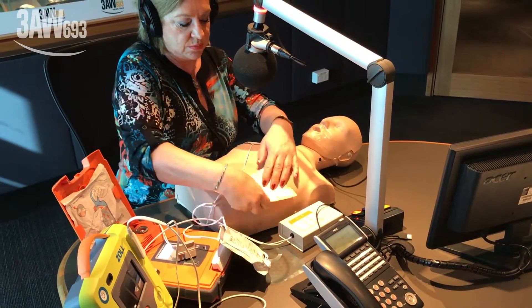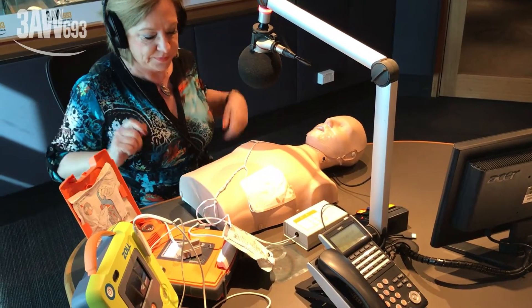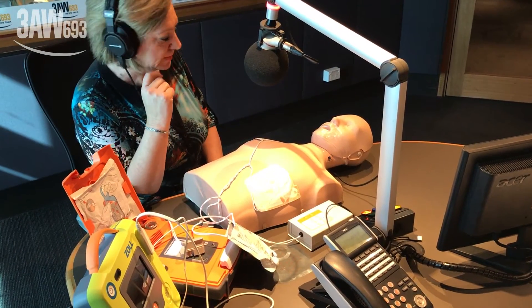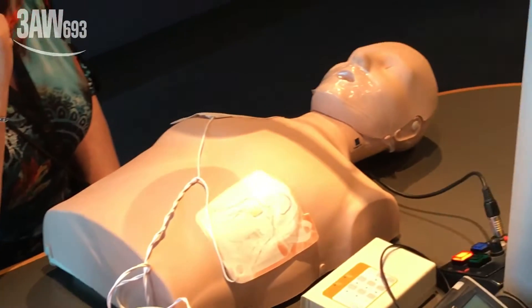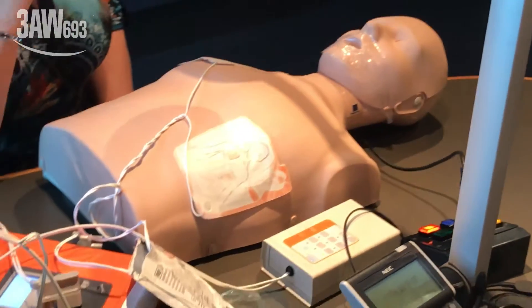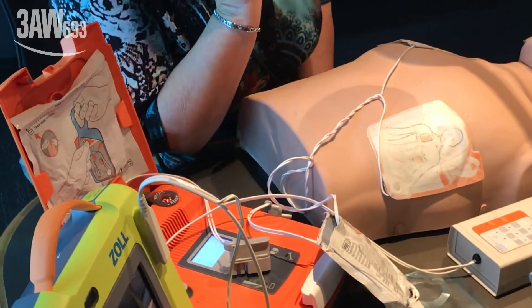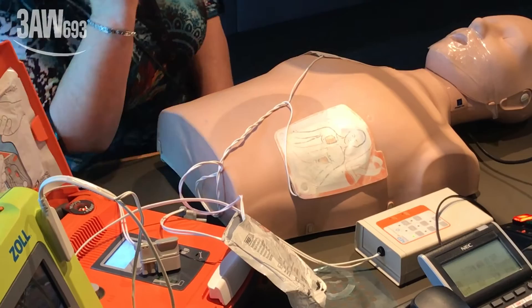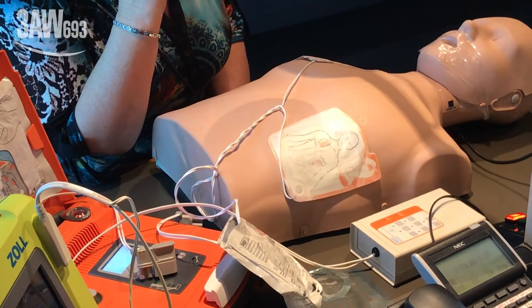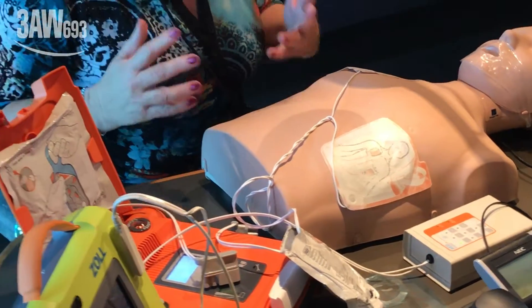The AED says: 'Do not touch the patient. Analyzing heart rhythm. Please wait.' You just stand back. 'Do not touch the patient. Analyzing heart rhythm.' Then: 'Shock advised. Do not touch the patient. Shock will be delivered in three, two, one.' Shock delivered — and the person would jolt.